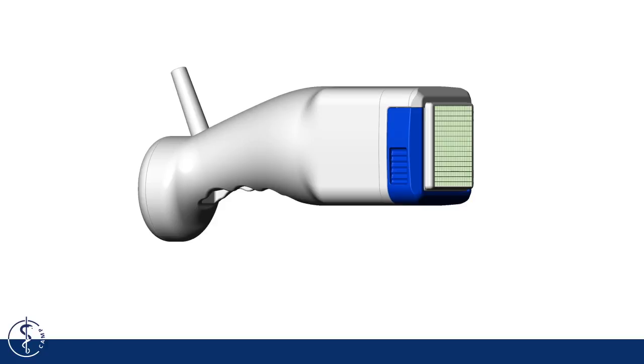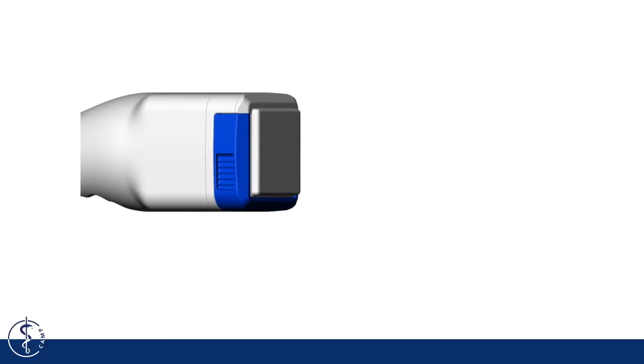The gamma probe we have used so far is actually only a single pixel detector. Recent advances in detector hardware development have allowed the design of relatively lightweight handheld gamma cameras. The combination of these cameras with the previous ideas of tracking the detector enable us to produce images with a much superior quality in terms of resolution and shorter acquisition times.